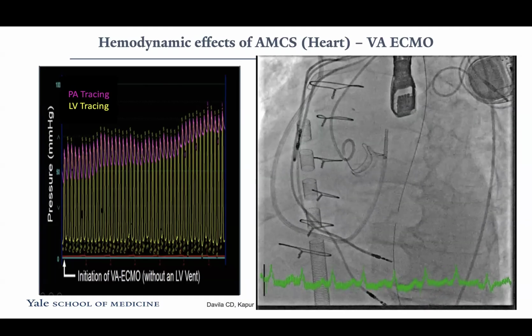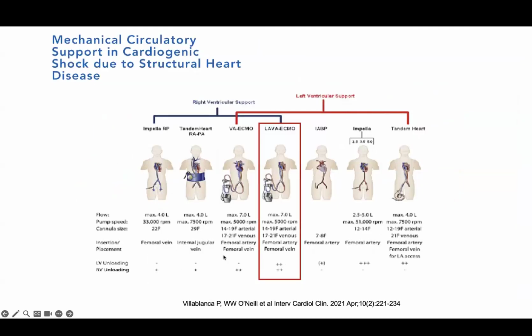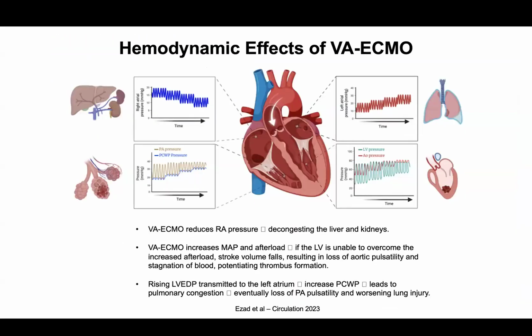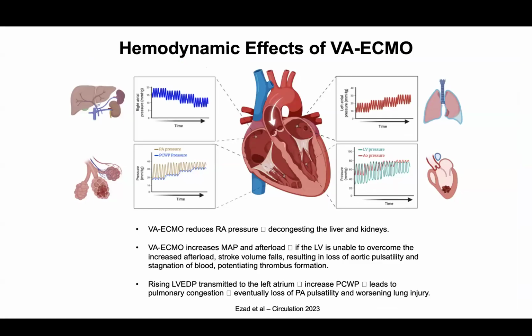How do you fix that? The OR. Go to the OR. They usually don't take them. But you vent the LV. How do you do that? Do the LA, like TandemHeart. Nobody uses Tandem anymore.